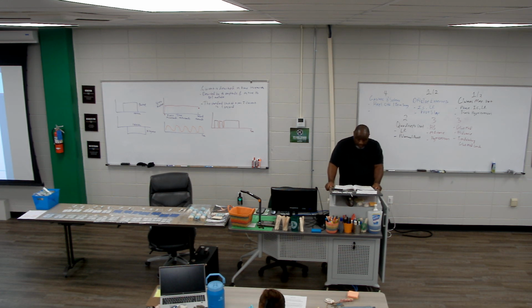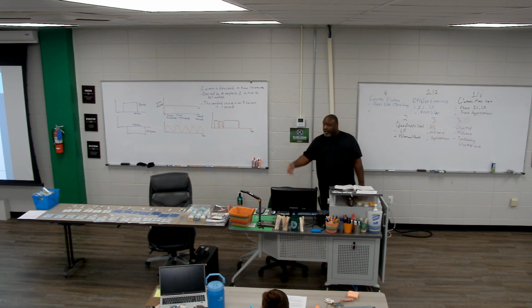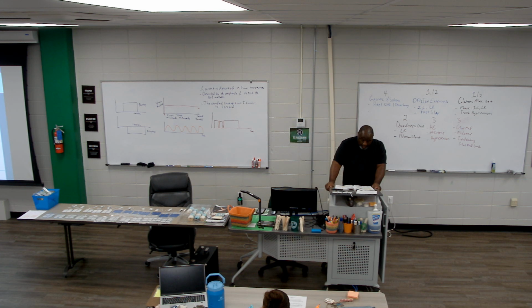So amplitude is the first thing that we have the ability to adjust. Depending on the stimulator, it's either a knob at the top of the device, or it may be a button you click to do it. Each device is different, but they all have the ability to adjust the amplitude. Next thing we'll talk about is, hang on. Well, no, let's stay with amplitude. It's giving us some good information.